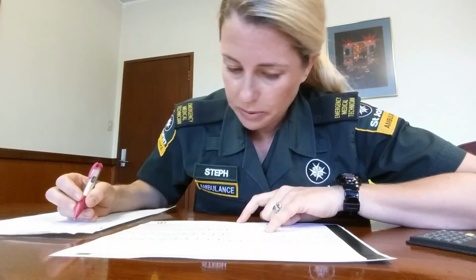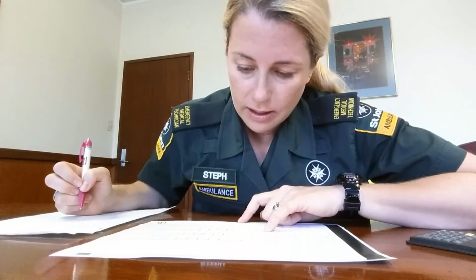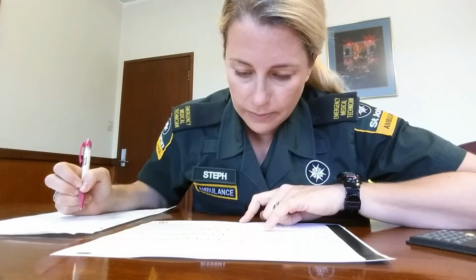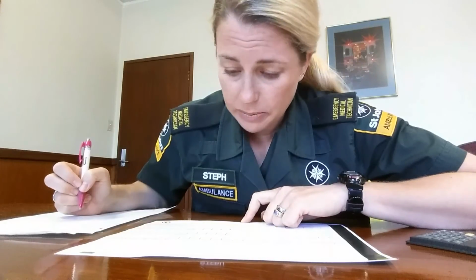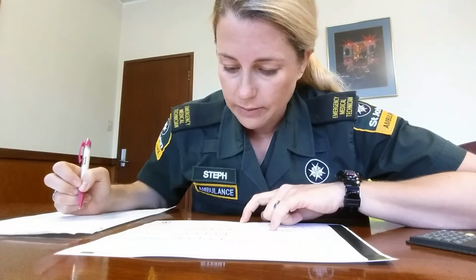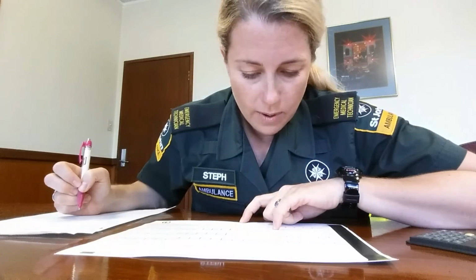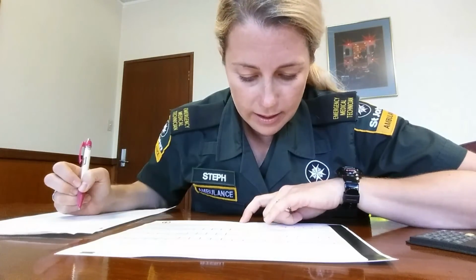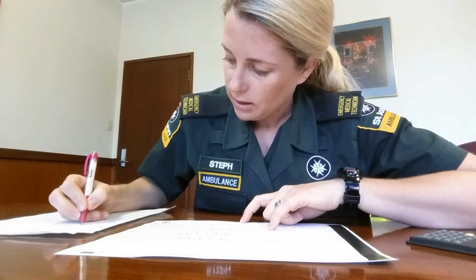We don't have any bundle branch blocks. And then hypertrophy, we're looking for the Sokolow-Lyon criteria, so add the R waves and the S waves need to be greater than 35, which they are not. In V1, V2, V5, and V6, needs to be greater than 12 in lead 1, 11 in AVL, and 20 in AVF, which we don't have.